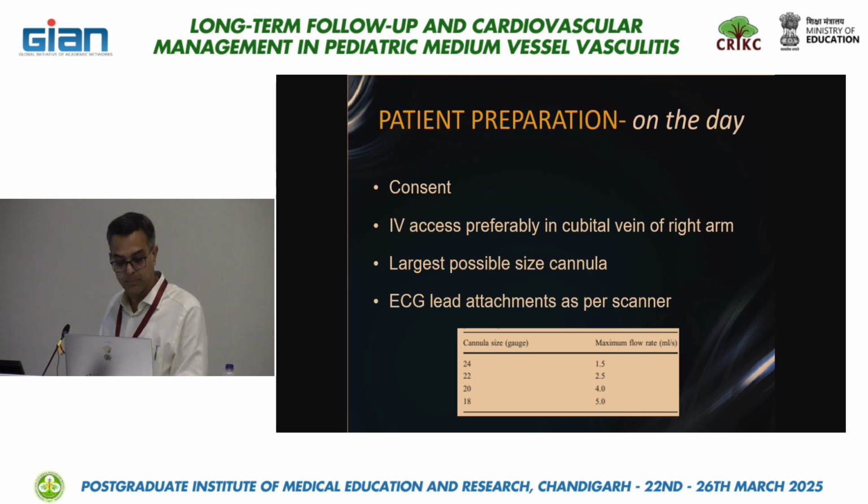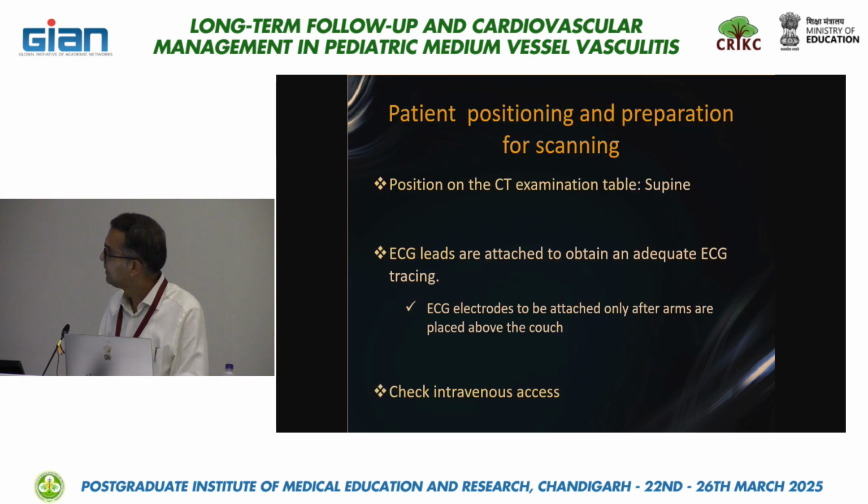Then comes the placement of the ECG leads, and then we take the patient for positioning. The CT is acquired with the patient supine and under sedation. The technician also has straps to strap the child, so that there is no movement during the injection, or if there is inadequate sedation, it prevents the patient from falling.